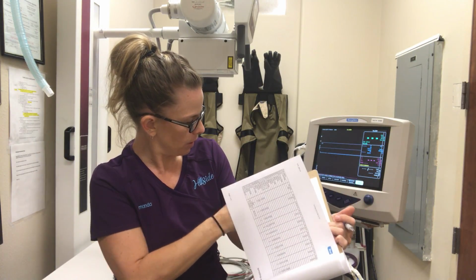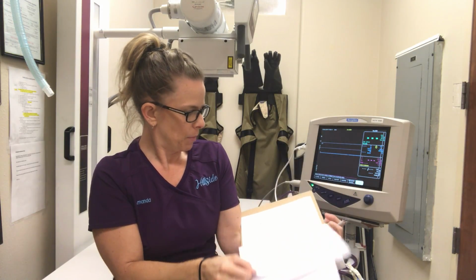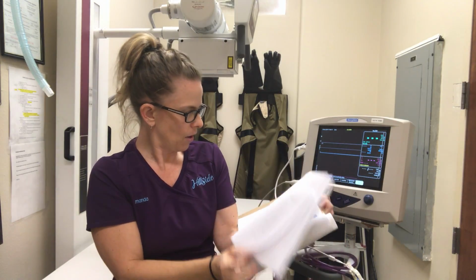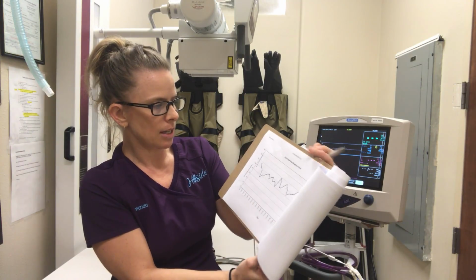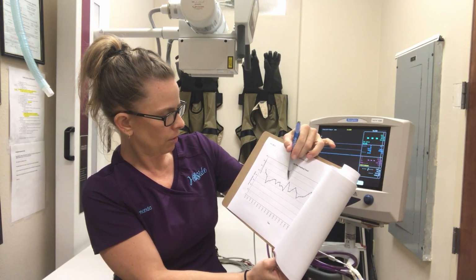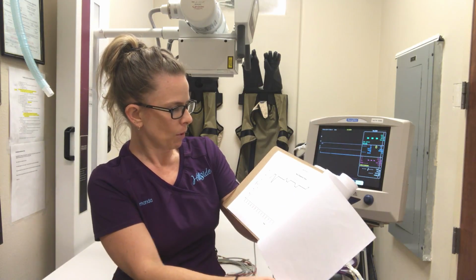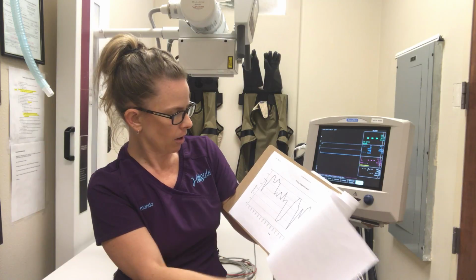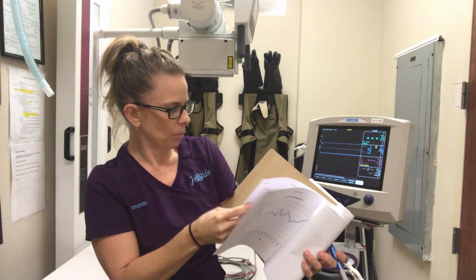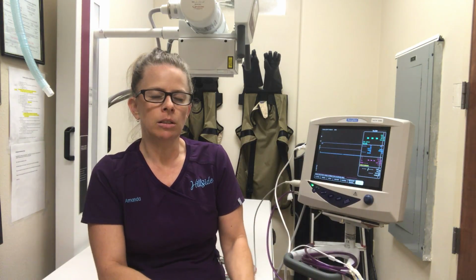So this kind of just breaks it down for the entire procedure. This was a dentistry, so it was a little long, but it breaks it down by graph as well, so you can actually have a big picture of how they were doing exactly. This is the ECG, so we can kind of see there's little waves here, but everything was relatively normal for this dog's procedure. We've got our SpO2 and so on and so forth, our end-tidal CO2 and blood pressure. So everything is recorded in their record, and it's just very important that you're monitoring that.